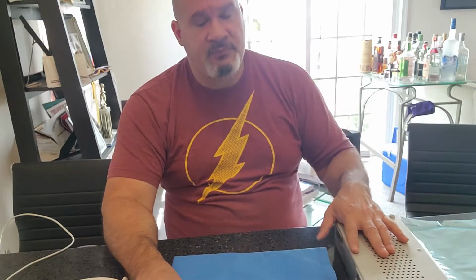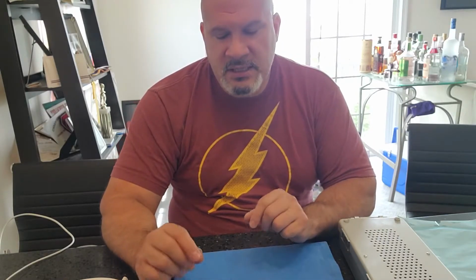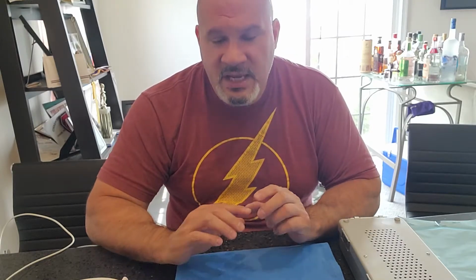It wasn't until I gained further certification and dug deeper into my knowledge that I realized that, oh, we do have a choice as to what sterilization packaging system we can use. The one thing we need to look at is the parameters of that medical device. I'm going to use it very general: 270, 4-minute exposure time.